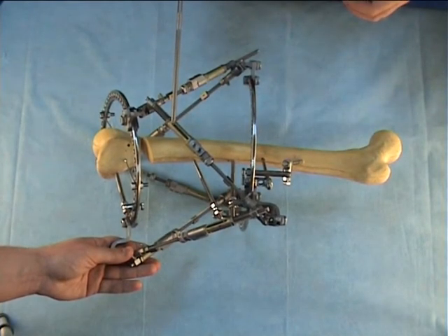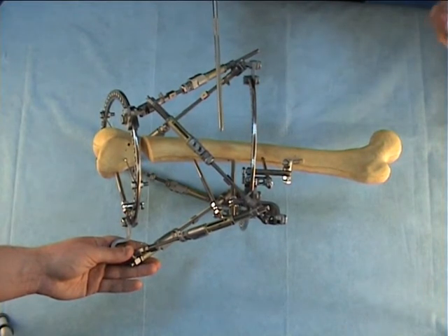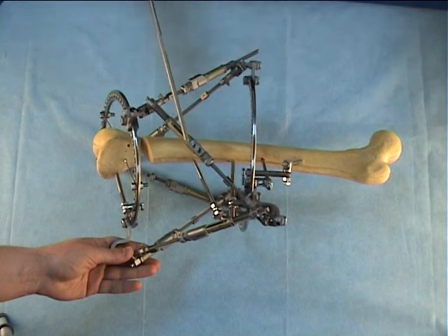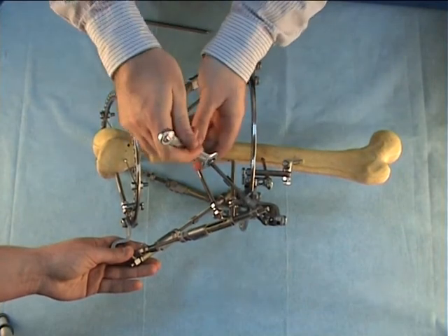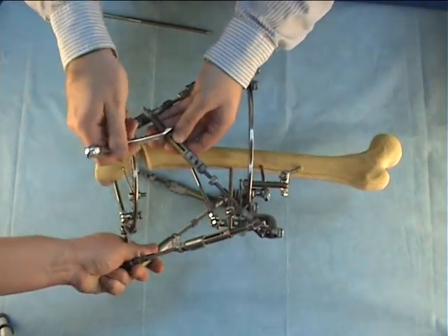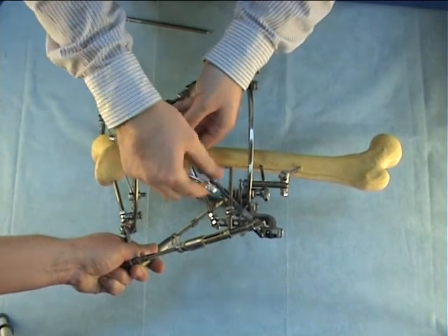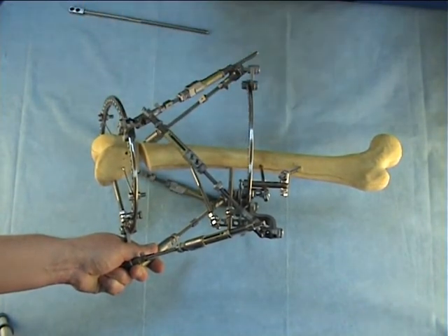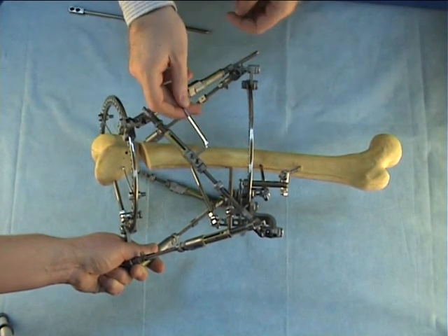Here you see an example in which the strut, while making gradual deformity correction, reached its maximum length. You see the indicator of the strut, which shows that the yellow cylinder is at its final position. So, what should we do? First, we have to untighten the lock nuts by 12 millimeters range.